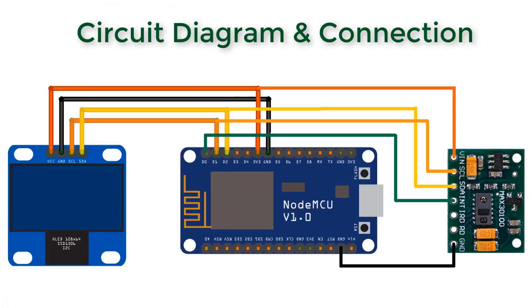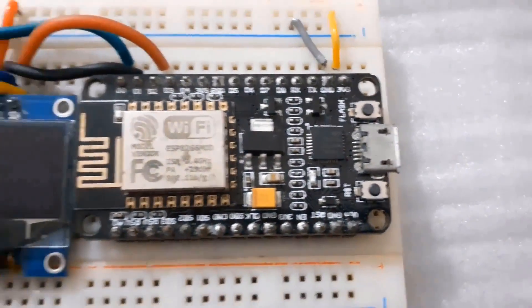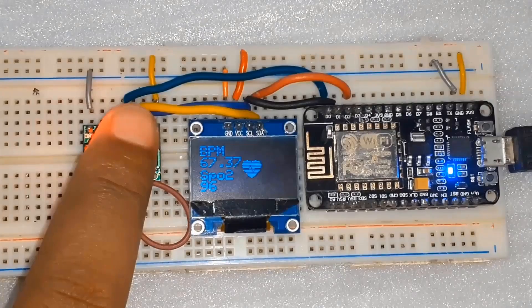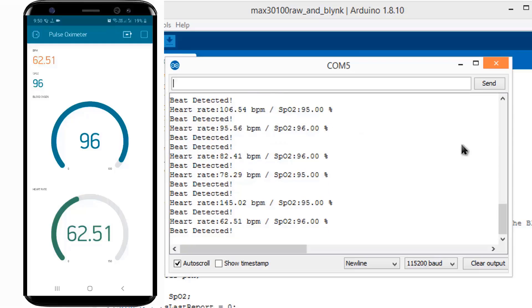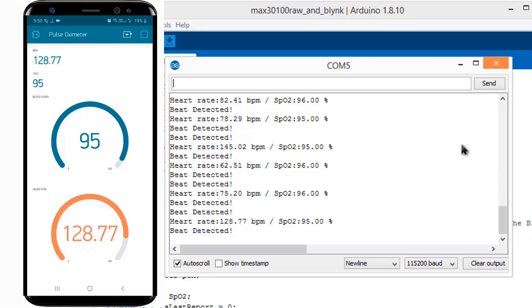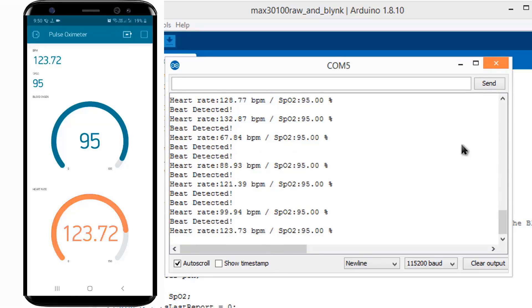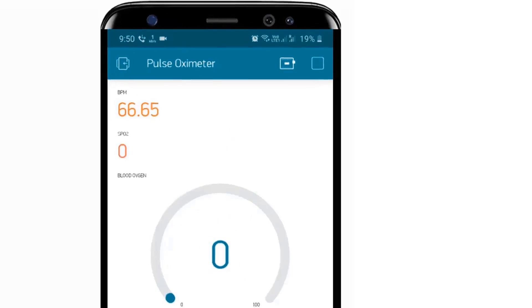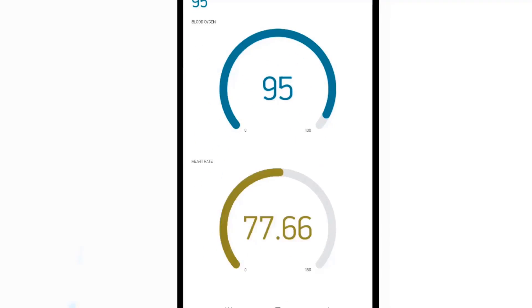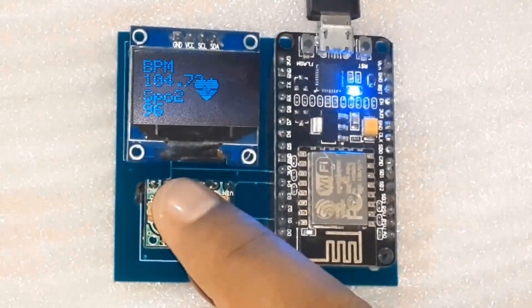Today I am back with the advanced version of the project. We will make an IoT-based smart blood oxygen and heart rate monitor. For this, we will interface the MAX30100 pulse oximeter with NodeMCU, display the values on an OLED, and using an IoT Wi-Fi cloud service, send the data to the Blynk application. Using the Blynk application, the patient's health can be monitored from anywhere in the world. Later, we will make a portable version of this device using a PCB board from NextPCB.